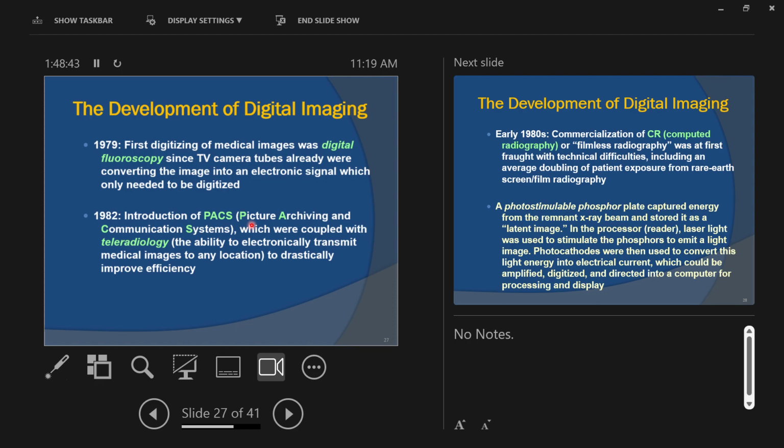PACS can be very simple. For example, our PACS system here at the school is just one local computer with a local hard drive, nothing offloaded off-site, no servers, nothing like that, really straightforward. And the larger your facilities are, the more advanced and complicated your PACS systems are.